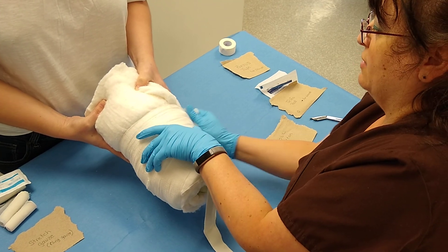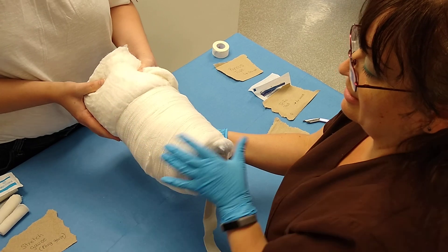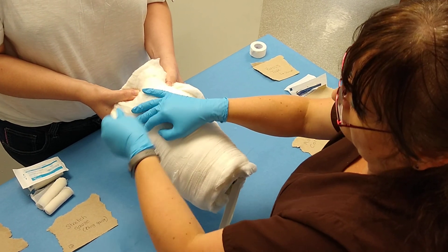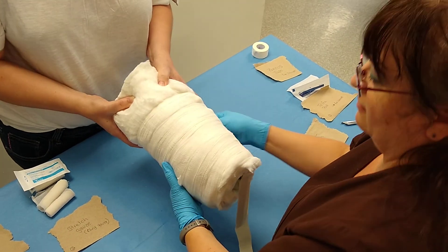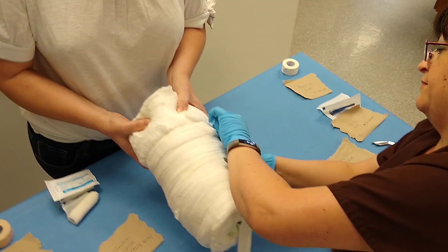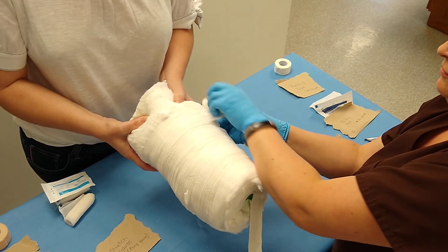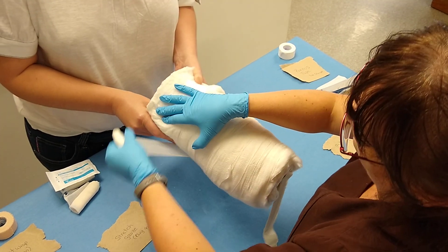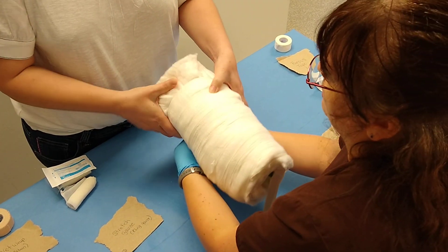This is a good point to show you that I'm snugging it down. Look at the thickness that I'm compacting the roll cotton. I am making it tight. It takes a little while to do this part. Hopefully your patients are sedated for it.